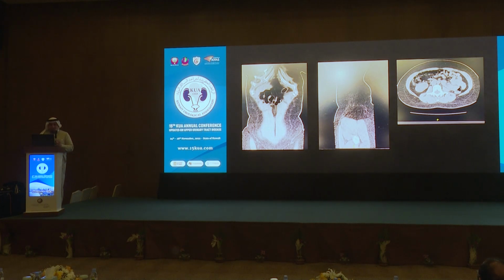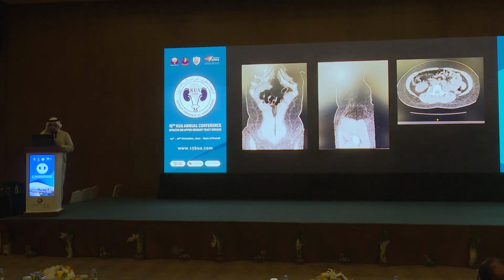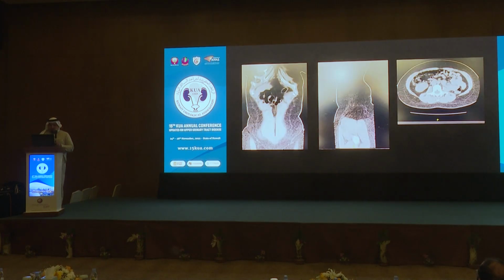This is the last case I want to show you. We didn't manage this case yet. Unfortunately the video is not working, but this is a pelvic kidney with multiple big stones. So initially, we wanted to evaluate the patient. We did an RGP and put a DJ stent just to relieve her symptoms.